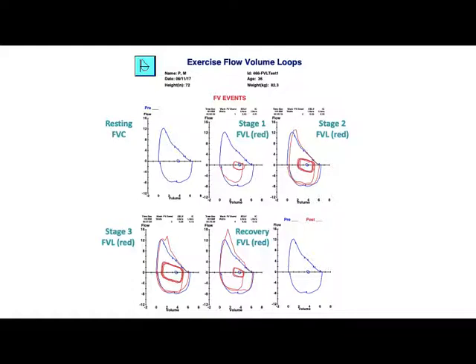And compared to rest, you can see this is my pattern of breathing. This is what my breaths look like or how I handled that exercise intensity. You can see the peak flow rate and how flow rate changes with every breath. There's an inspiration, expiration, and all of the loops are each individual breath. You can't get any information about frequency of breathing here unless you count the number of loops. What you can get are information on flow rates, so peak flow and how flow changes with each breath. You can get information on tidal volume, the width of this loop. And you get information on where this sits within the lung. So where is tidal volume in relation to forced vital capacity or lung capacity? Where is it in relation to residual volume?